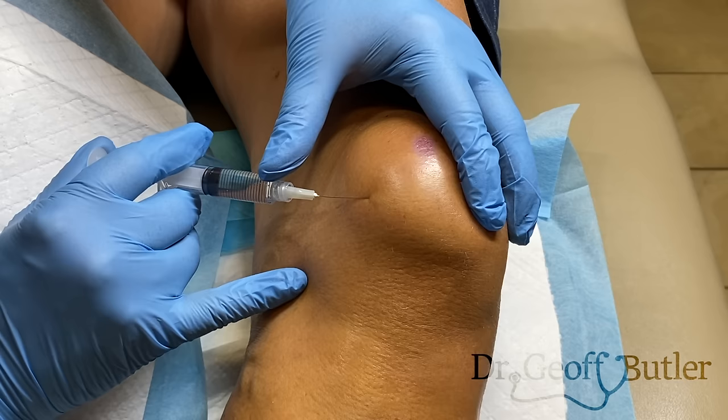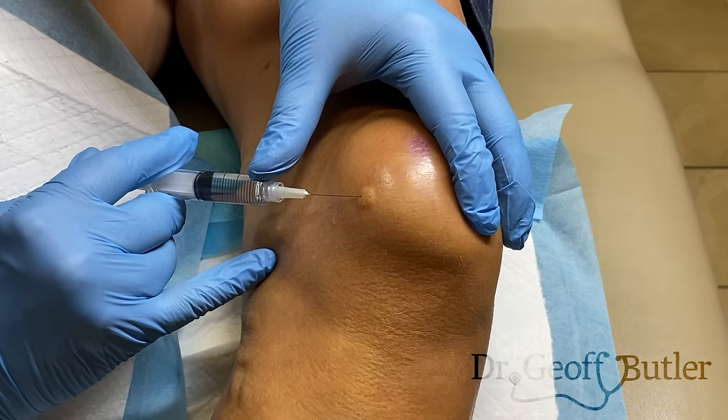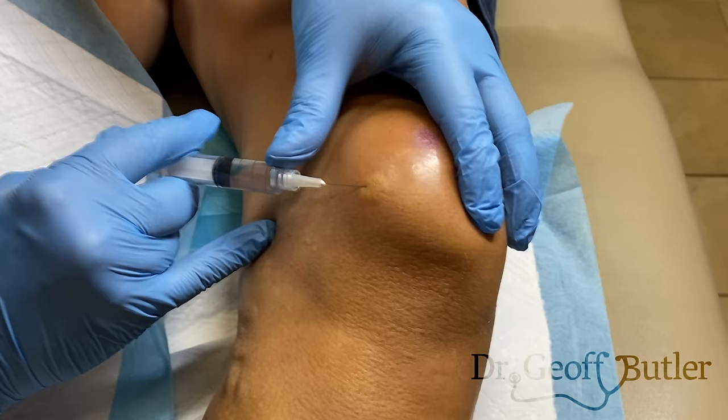I'm going to add in a little bit of freezing here — she's going to feel a poke and a little bit of burning. We want it to bleb up like that; you want it to be superficial. If I inject it into the capsule, which is already extended, it's just going to create more pain. I'm keeping it superficial on purpose, though I could try to get deeper with it.